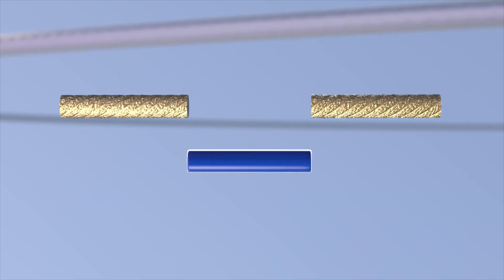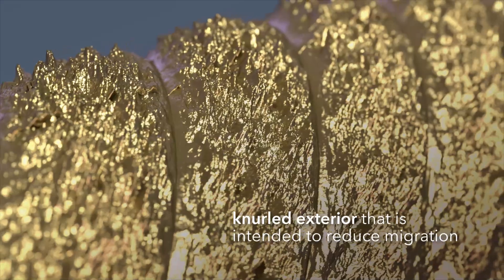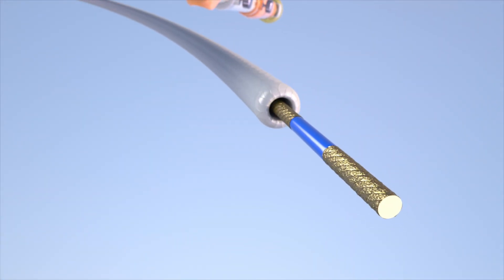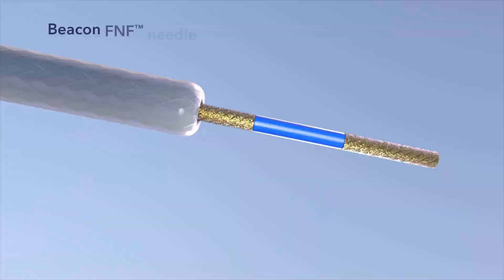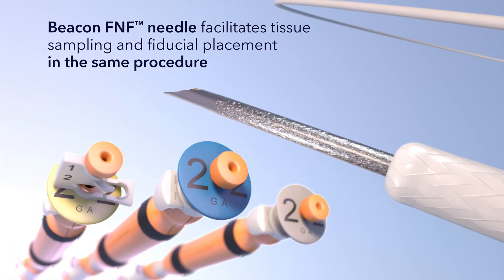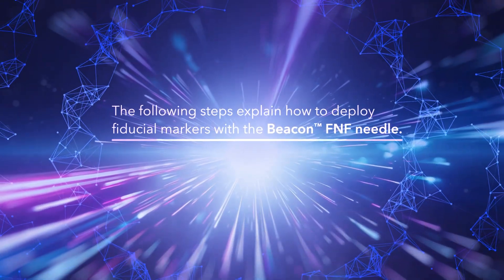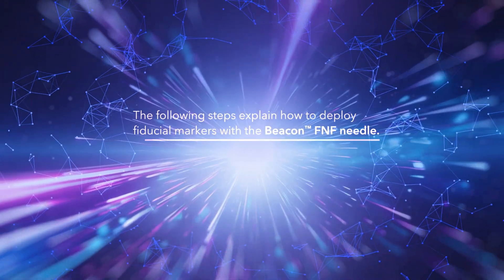Each fiducial marker features a knurled exterior that is intended to reduce migration. As an interchangeable component of the Beacon EUS delivery system, the Beacon FNF Needle facilitates tissue sampling and fiducial placement in the same procedure. The following steps explain how to deploy fiducial markers with the Beacon FNF Needle.